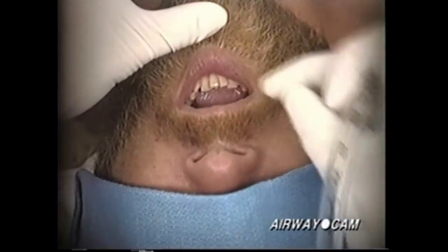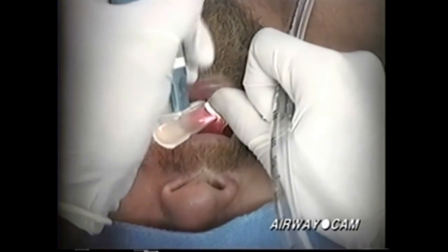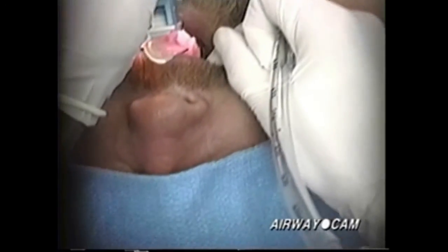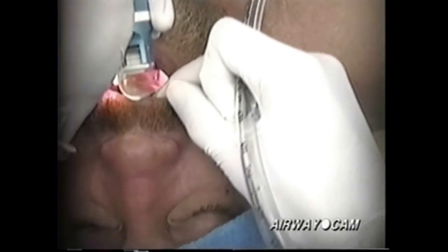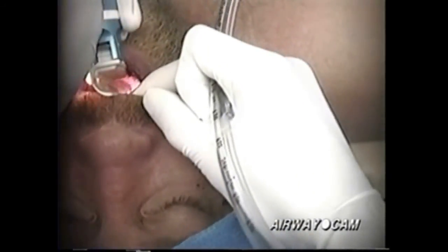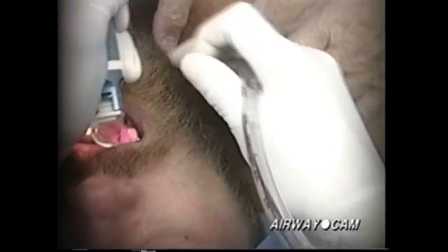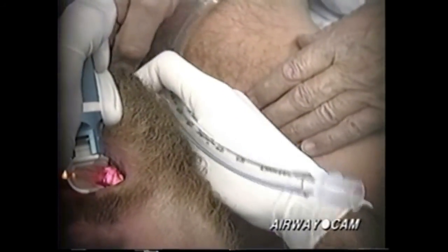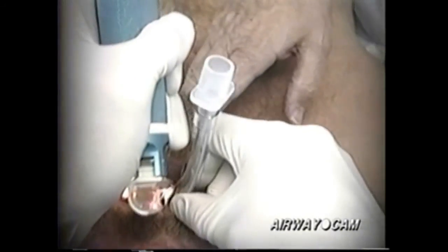This next intubation with a Miller blade shows posterior pharynx, epiglottis, and esophagus as the blade is advanced, withdrawn, and re-advanced in an effort to directly elevate the epiglottis. Unlike the curved blade, the straight blade has no stability along the curvature of the tongue and no natural stopping point since it is not positioned into the vallecula. The laryngoscopist reaches around to the anterior neck with his right hand to posteriorly displace the larynx, bringing it into better alignment with his line of sight. Retraction of the upper right lip aids visualization as the tube is passed.